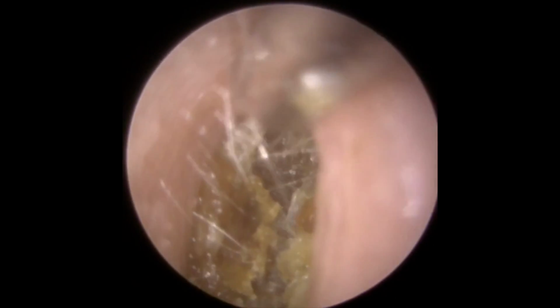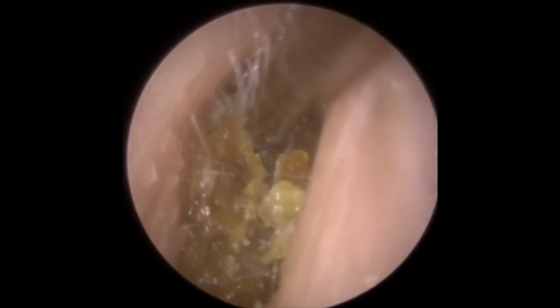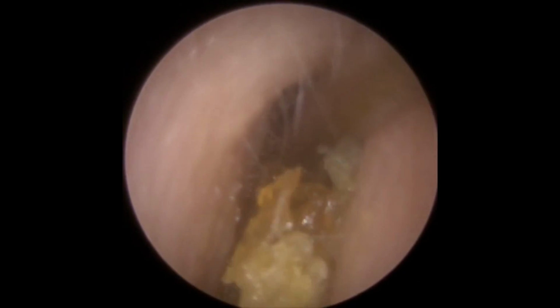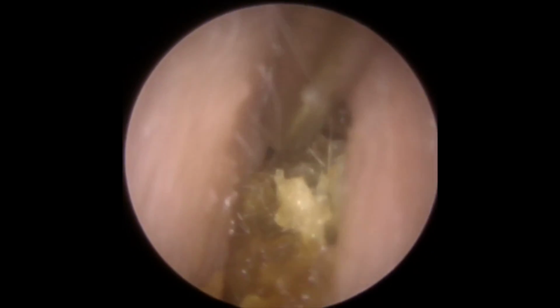Okay, so there we go. So I'm pressing down into the wax there. Now you can see it's starting to come forward. So I'm using the fine end almost a bit like suction and Jobson horn at the same time. So I'm getting into the wax, bring it forwards, using the suction to help, getting behind it. Because the Jobson horn is just too big, we can use this fine end like that just to bring this forwards then. So you can see now we've broken a piece away, which means this is starting to come away a little bit more effectively.